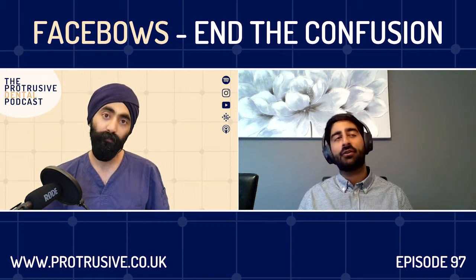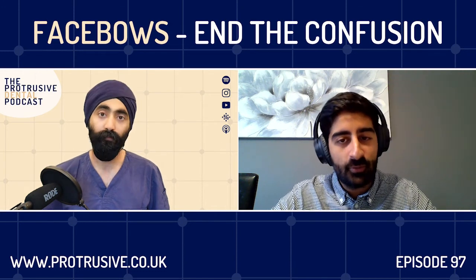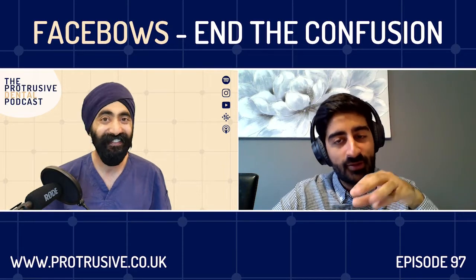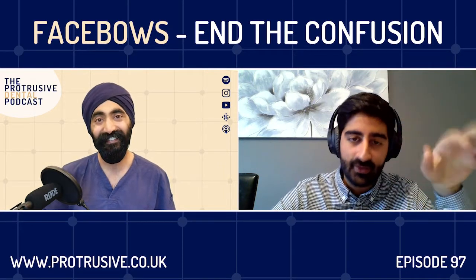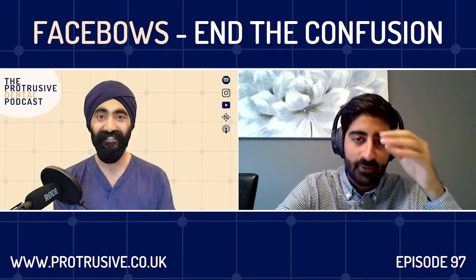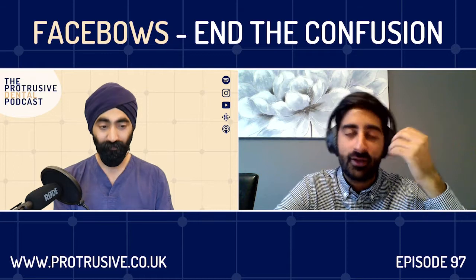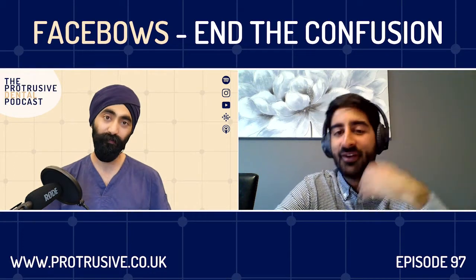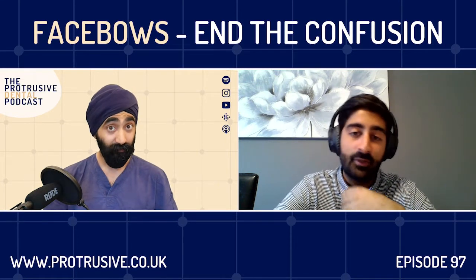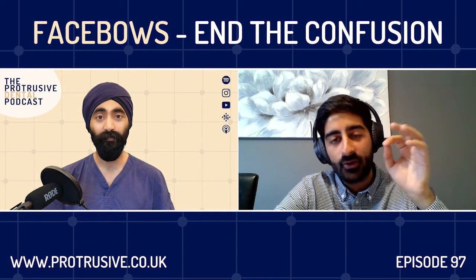Yeah, the only big thing I want to note though is that this is not me saying do not use Facebows at all, because of those initial temporaries. This is the old school opinion I'm about to give you: those initial temporaries were made from a wax-up, which you've had on articulated casts, which you've had a managed opening and closing of the OVD, and you only get the accurate wax-up and the accurate planning and the accurate diagnosis by having a set of properly articulated study casts. You only get a set of properly articulated study casts, in my opinion, with a facial record, so that you can open and close the pin properly. And so if you've got a really great wax-up and then you make temporaries from that, and then you do those really minor adjustments to those temporaries, then you're almost perfect on that day of delivery.